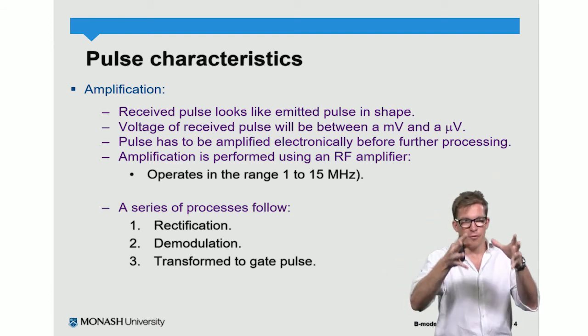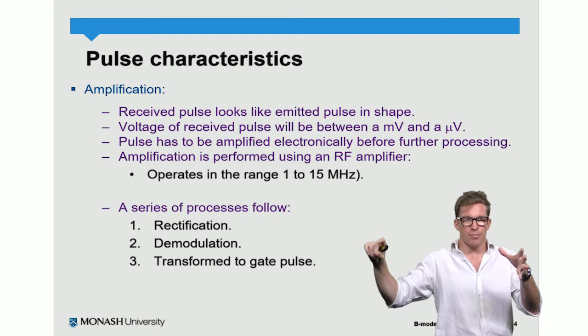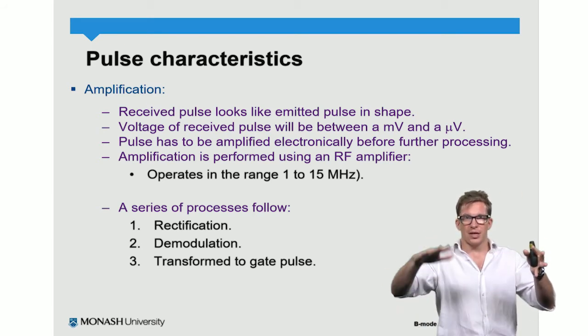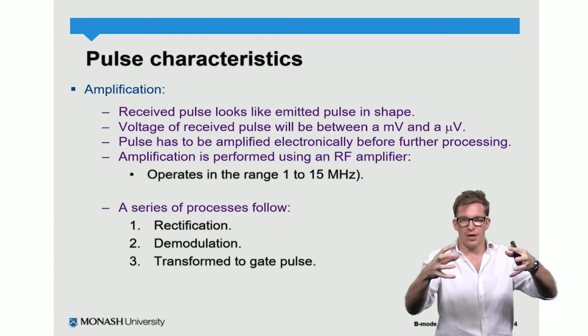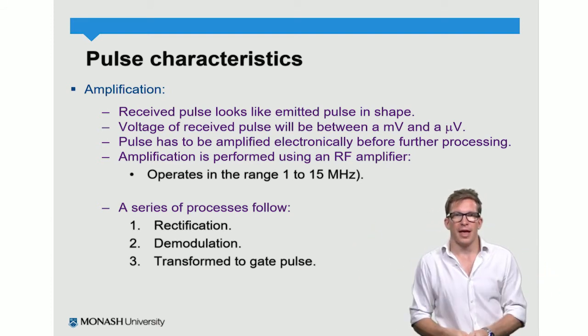We want to get from that effectively to a step pulse that we can digitize, which gives us a number that's representative of how strong the reflection of that wave was. So that's going to be our goal, to go from this oscillating waveform that covers an expanse of time and convert that just into a single number which tells us how strong that reflection was.